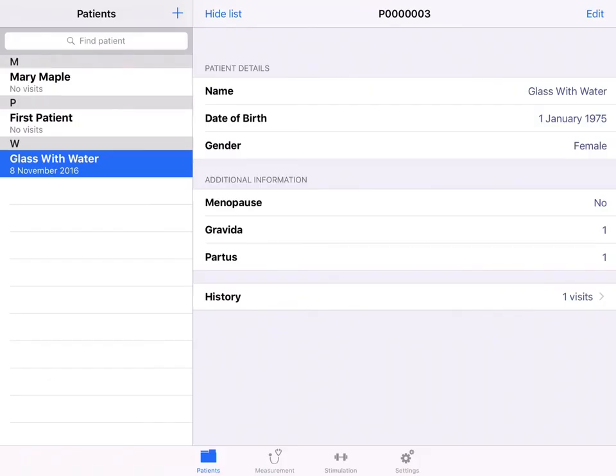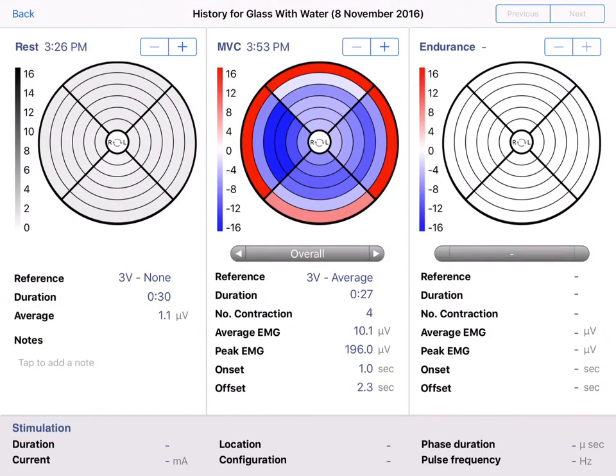Under history you can view the saved measurements. You can flip through previous patient visits with the button on the top right. Use the buttons previous and next to flip through each visit.